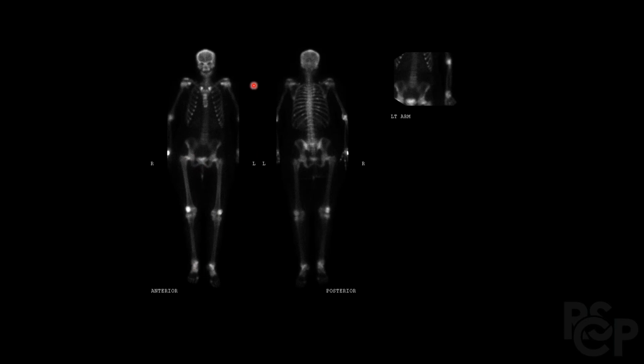So again, this is indicative of metabolic disease, as we can see by the diffuse pattern, very symmetrically identified in the joints area and in the sternal tie and the costochondral ribs, which are all the signs that you would look for in identification of metabolic bone disease.